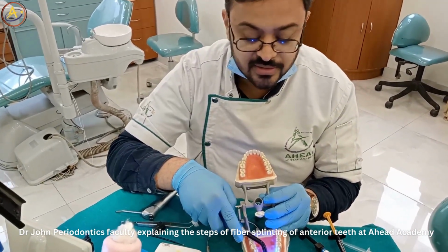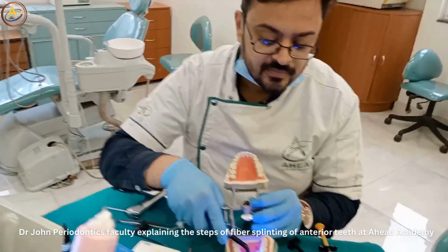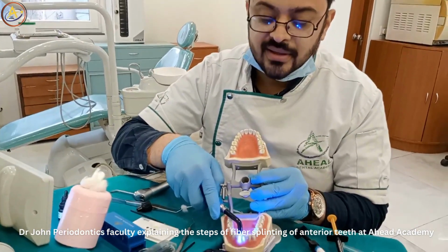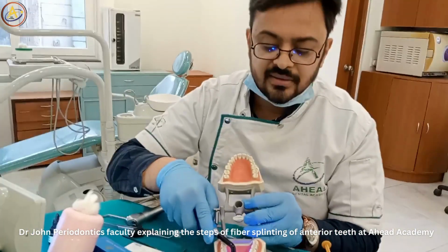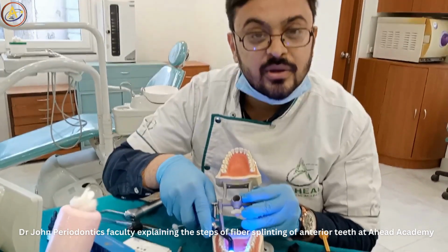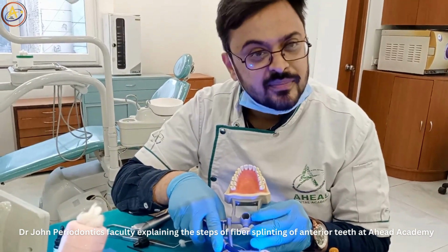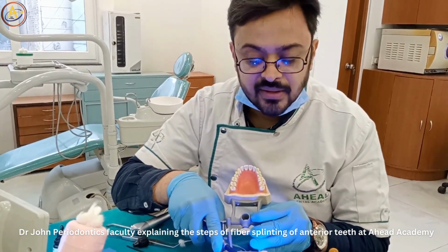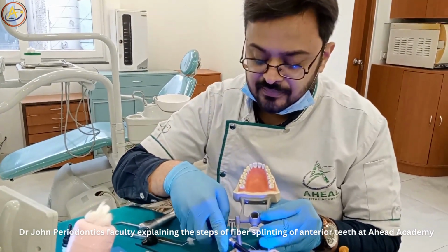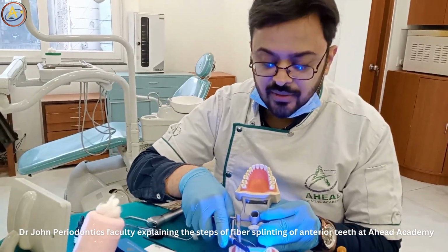So we are curing the third tooth, and then we will cure the fourth tooth. Okay. 20 seconds is the timer you have set for the complete curing, and then you have to set and cure each and every tooth. Okay. Never do it randomly. Sometimes the bond doesn't get set. So try to do it separately on each and every tooth. Okay. So now I think we have completed our curing.